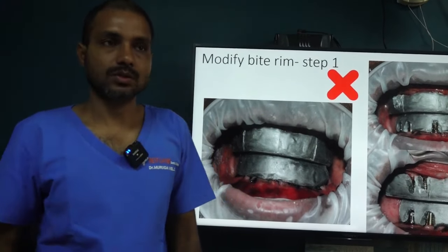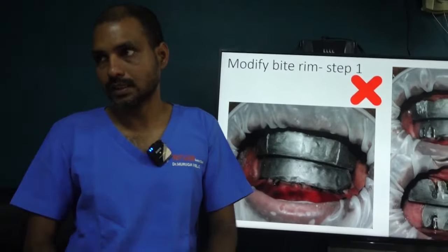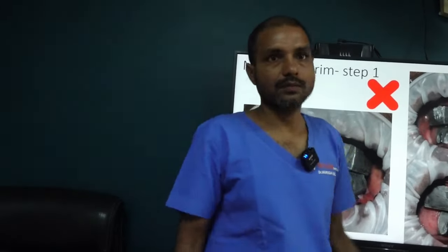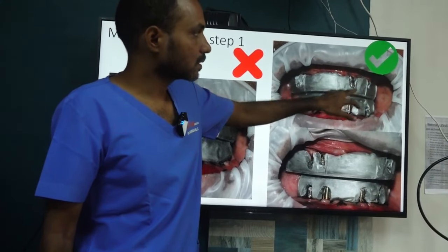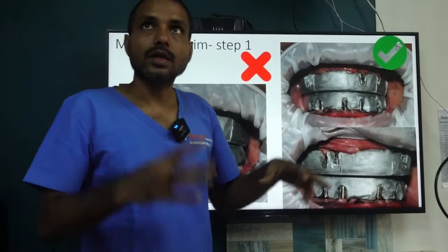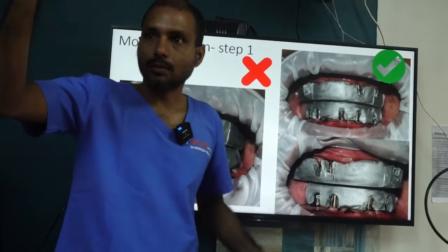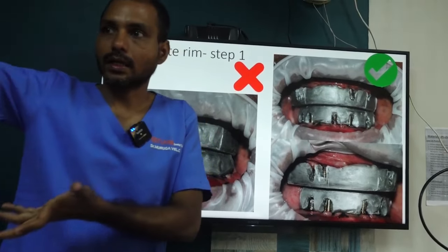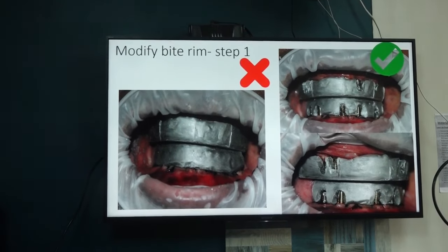That is how bite scan works. So you should know how bite scan works. It takes some landmarks from upper and lower and connects them. But there is no landmark here. We have to provide the landmark. Luckily, the implant is there. So when you take the bite rim scan, the scanner catches this. The scanner will calculate that this implant is this much length from here, so a correct VD comes there. Merging happens.